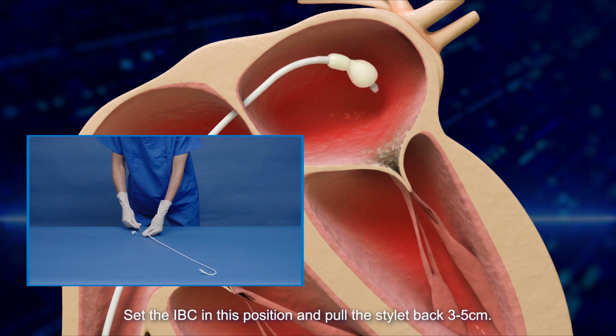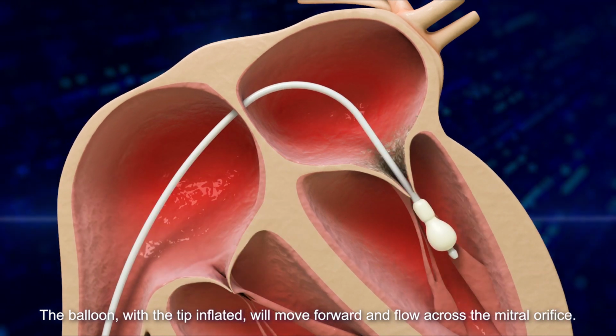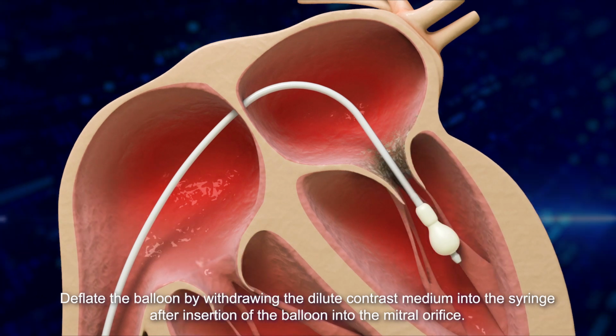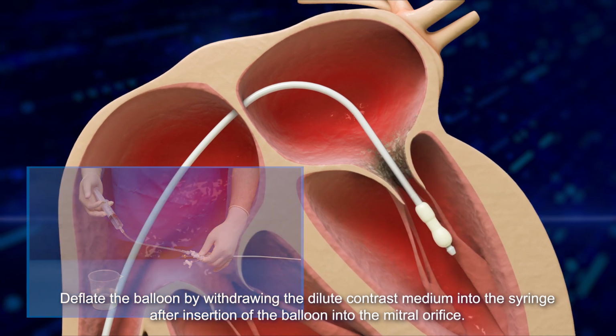Set the IBC in this position and pull the stylet back 3 to 5 centimeters. The balloon with the tip inflated will move forward and flow across the mitral orifice. Deflate the balloon by withdrawing the dilute contrast medium into the syringe after insertion of the balloon into the mitral orifice.